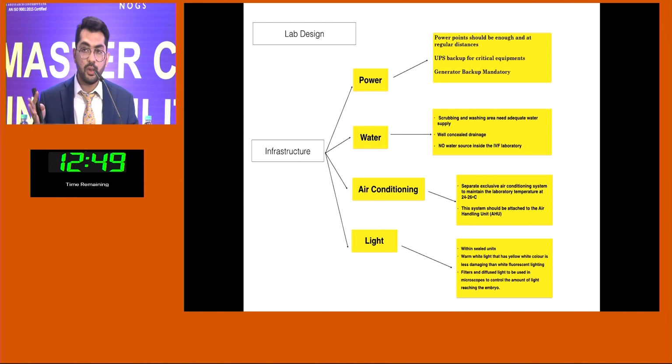And especially when you're thinking of an IUI lab, you don't really need to invest in an HVAC system or an air handling unit. Having a simple basic air purifier can actually help you, or a small Coda tower can actually help you in maintaining the air quality in that laboratory.